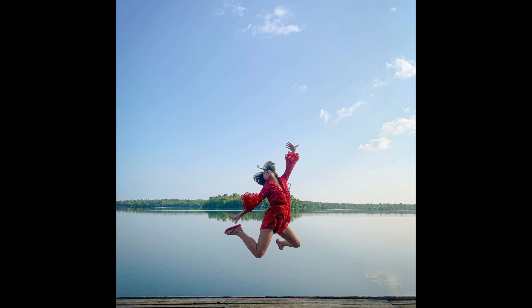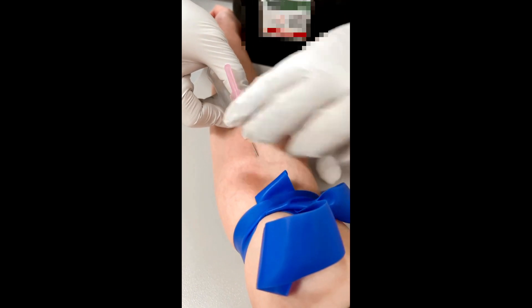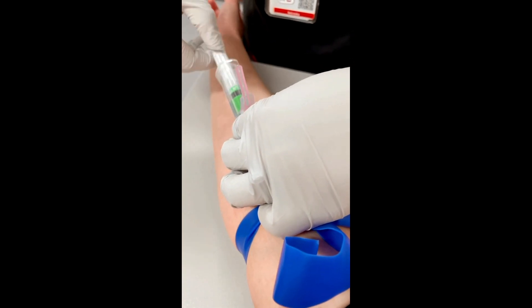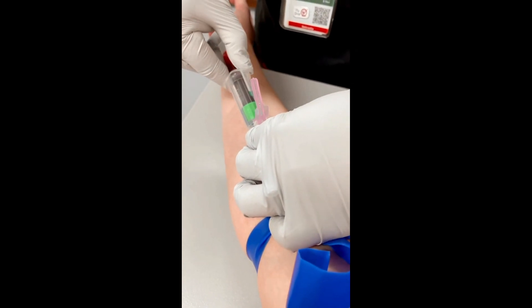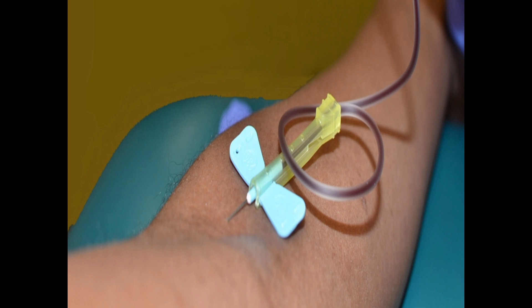Good day class! For today's topic, we will be discussing another method in order for us to collect blood samples from patients, especially for those patients who are having small, very delicate veins. This is through the venipuncture of a hand vein using a butterfly and an evacuated tube system holder.